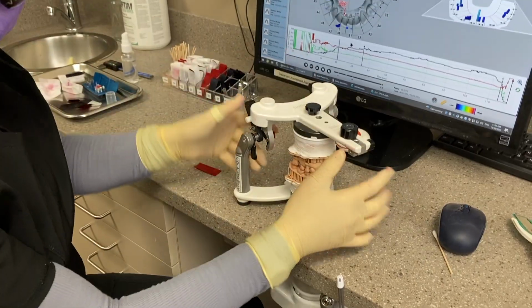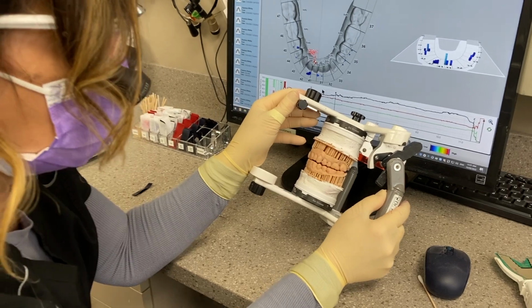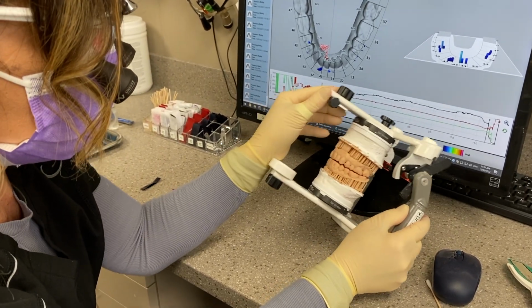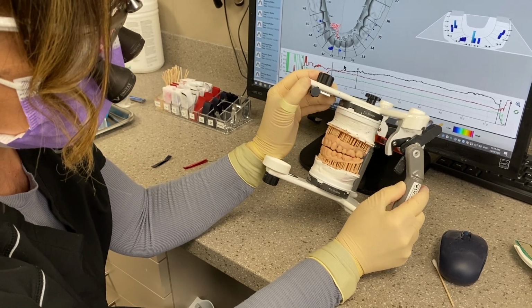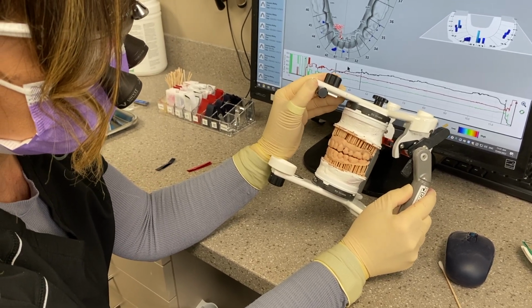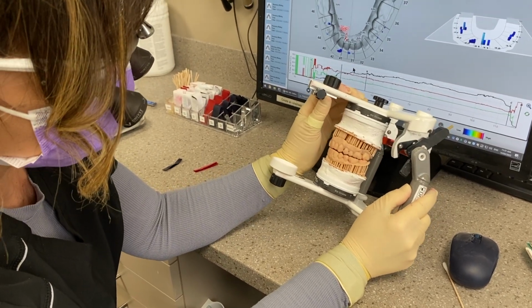We're going to switch sides and do lateral movements on the other side now. And again, I'm looking for canine, which I'm not going to get on this side whatsoever because the canine's super far away. So the challenge is going to be, do I leave her in group function of some sort, or do I restore? And that's something I can talk to her about.